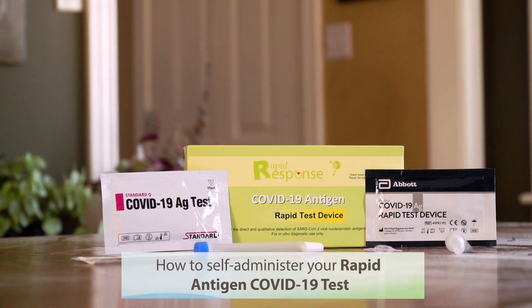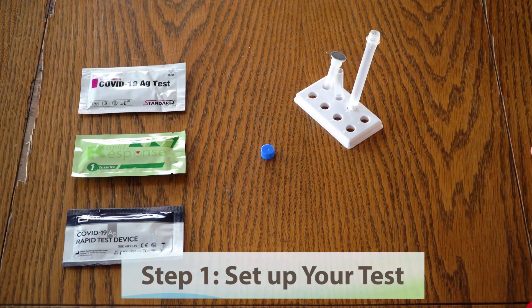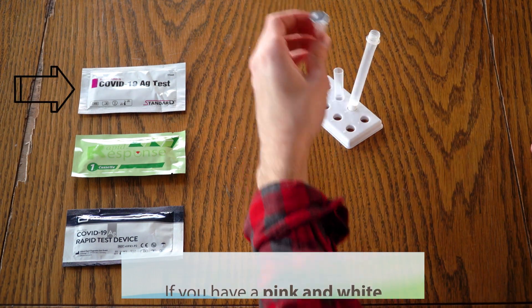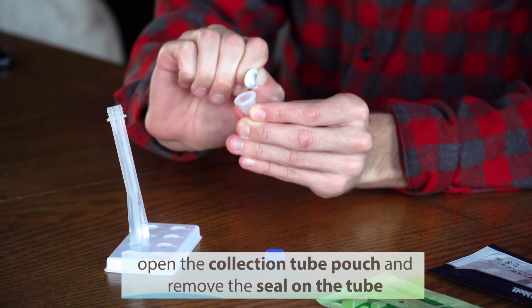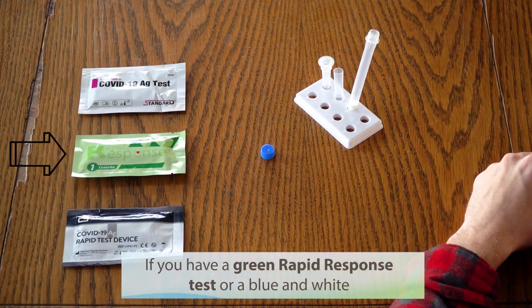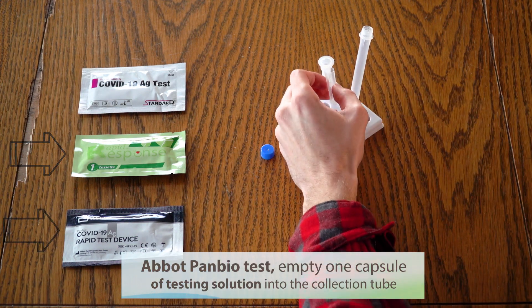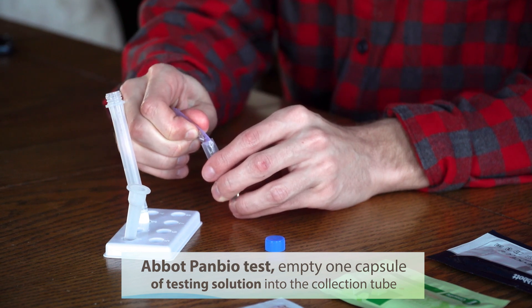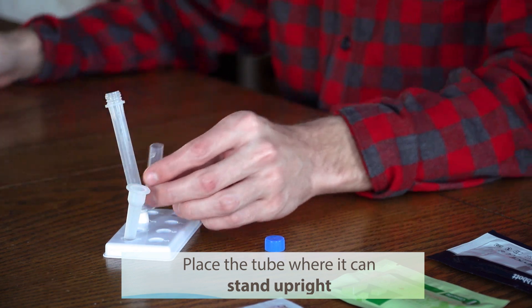How to Self-Administer Your Rapid Antigen COVID-19 Test. Step 1: Setup. If you have a pink and white SD Biosensor test, open the collection tube pouch and remove the seal on the tube. If you have a green Rapid Response test or a blue and white Abbott PanBio test, empty one capsule of testing solution into the collection tube. Place the collection tube somewhere it can stand upright.